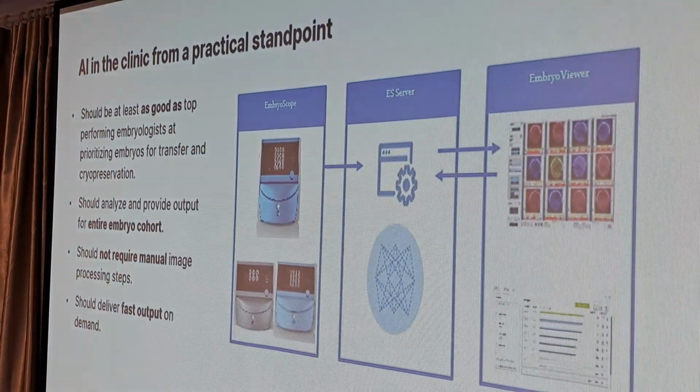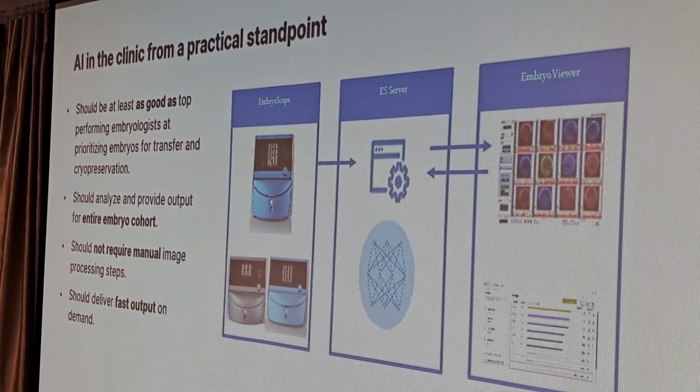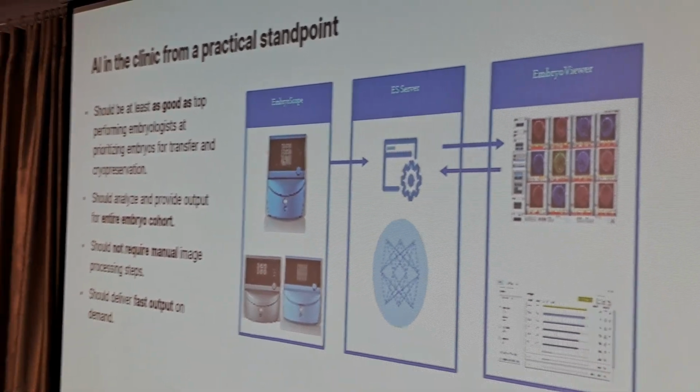And most importantly here is that the iDAScore algorithm must perform at least as good as your best embryologist. If it's not doing the same job, it's not worth it. But if it can be at least the same or better, then we have a winning situation.